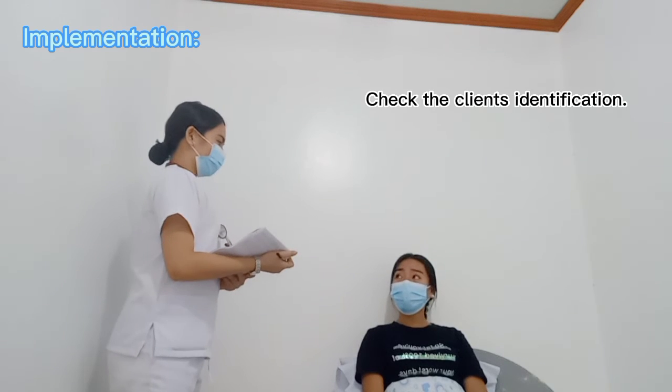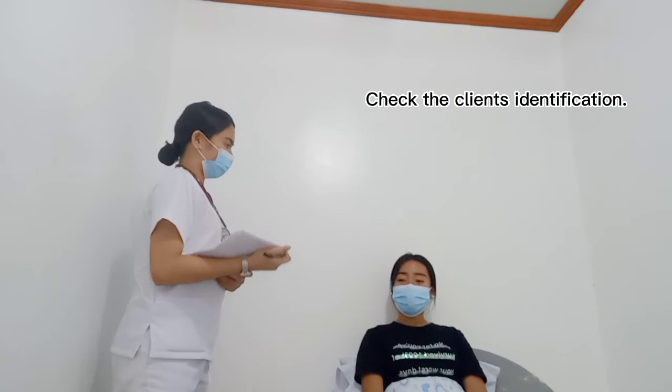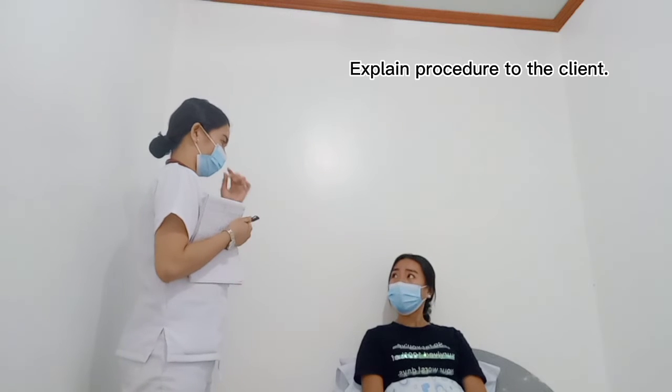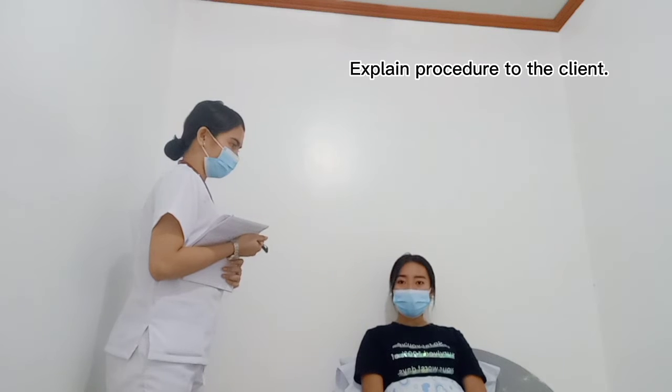Good morning, Mom. I am Princess May Madalo, your student nurse for today. Good morning, nurse. Okay, Mom, I have a few questions. Is that okay with you? Yes, nurse. May I know your full name? I'm Camille Dumpa. How old are you? I am 21 years old. Do you have any occupation? As of now, no. I'm still a student. Have you been hospitalized before? No. I'm going to check your temperature in your auxiliary using the thermometer. Is that okay with you, ma'am? Yes, ma'am.